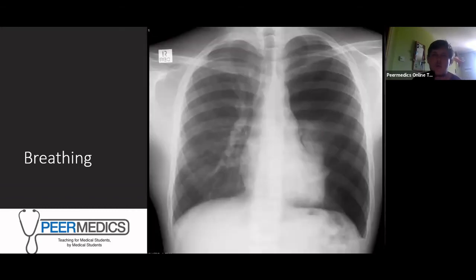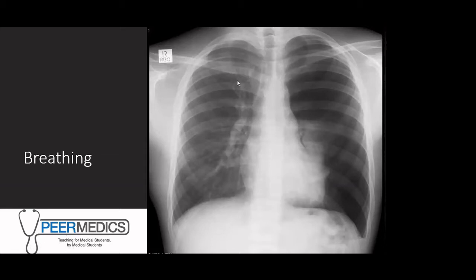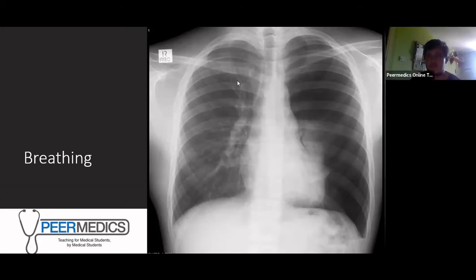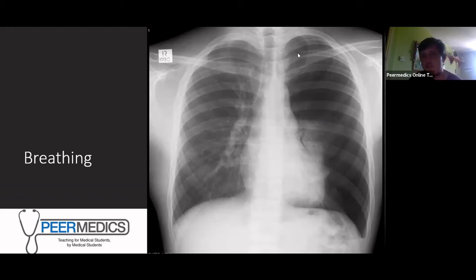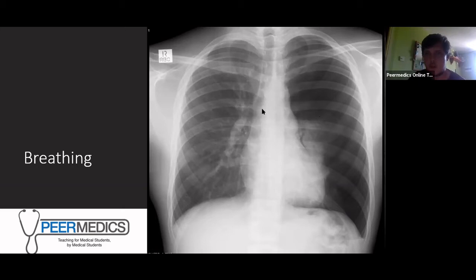This picture shows loss of lung markings in the left lung with slight tracheal deviation. On the right lung you can see lung markings all the way to the edges, but on the left there are dark spaces and you can just about see the pleural layers — a double layer visible where it shouldn't be. This represents a tension pneumothorax — a medical emergency requiring urgent lung decompression.